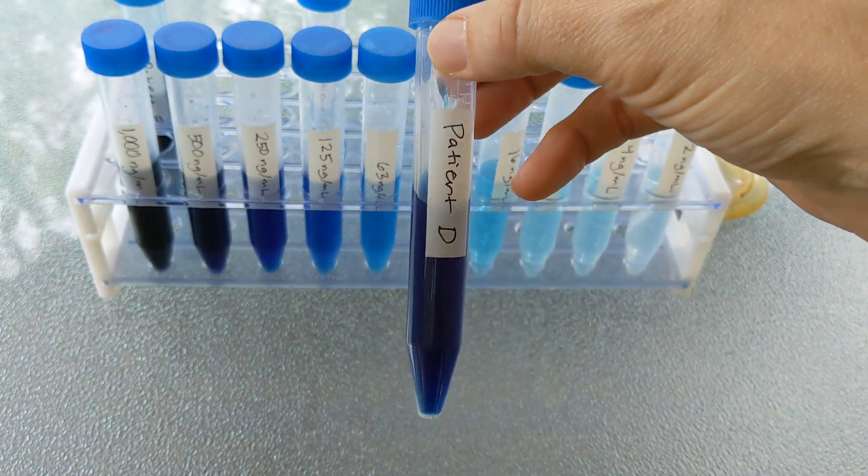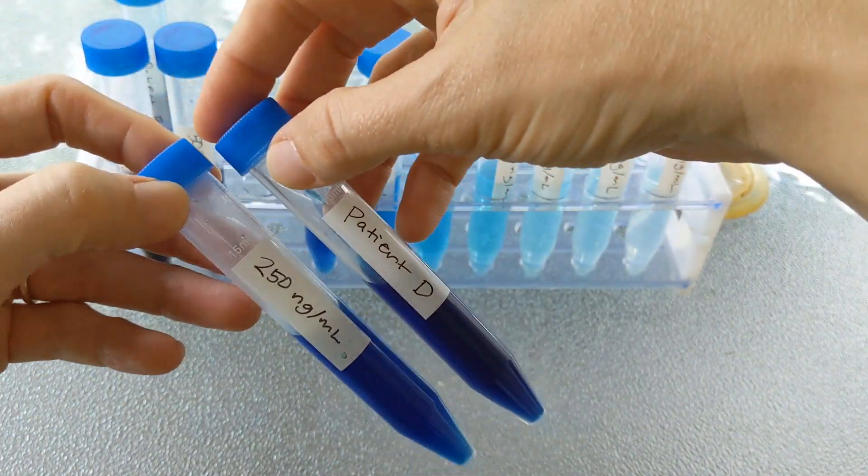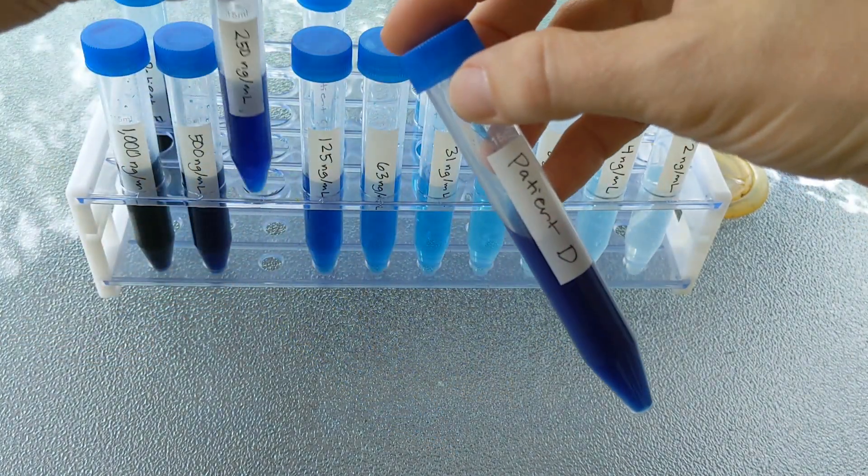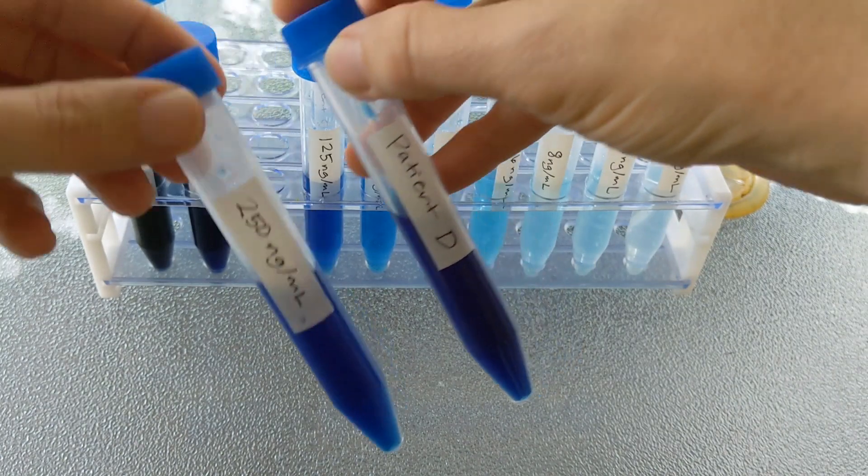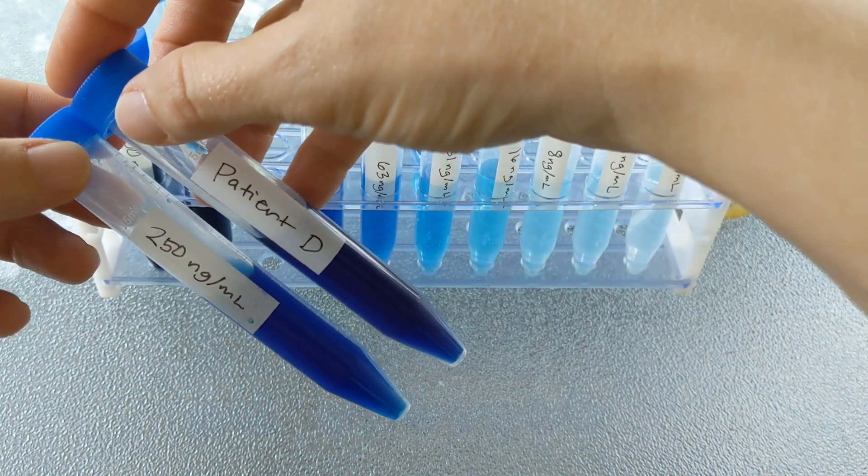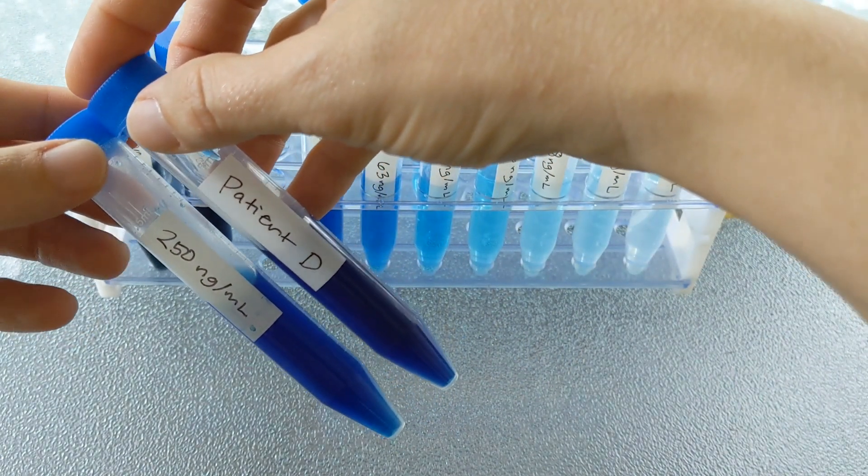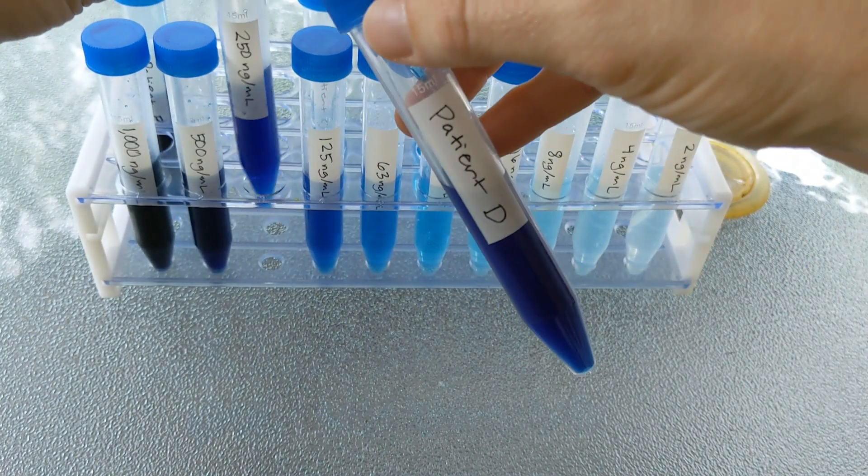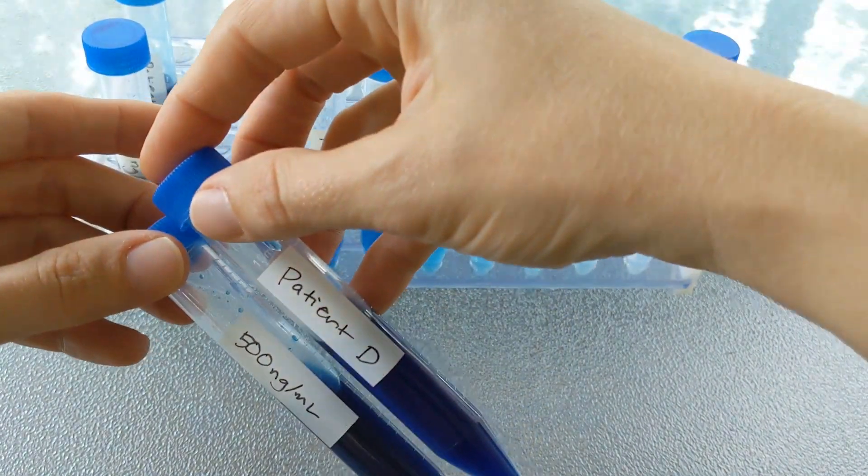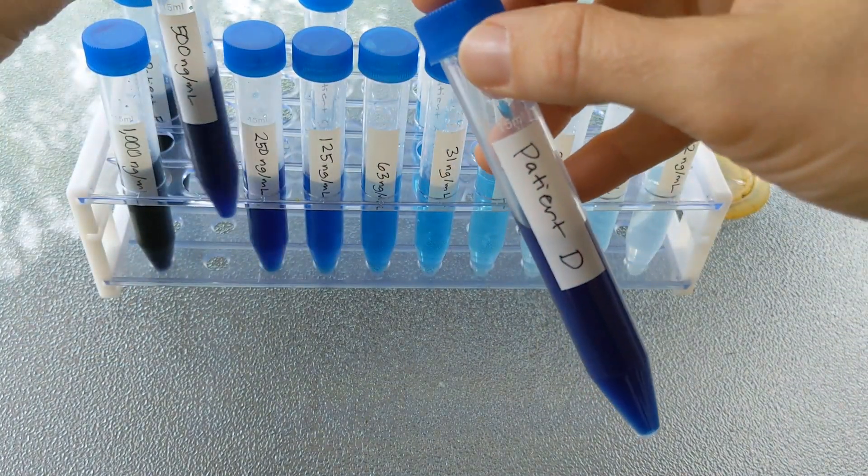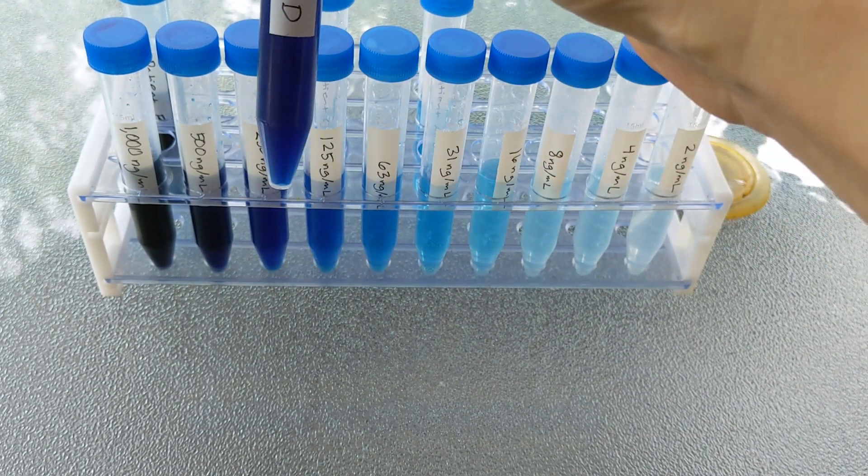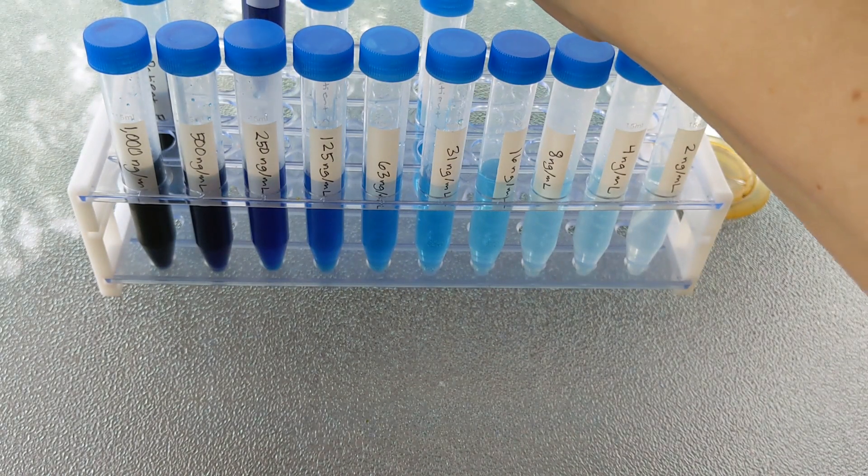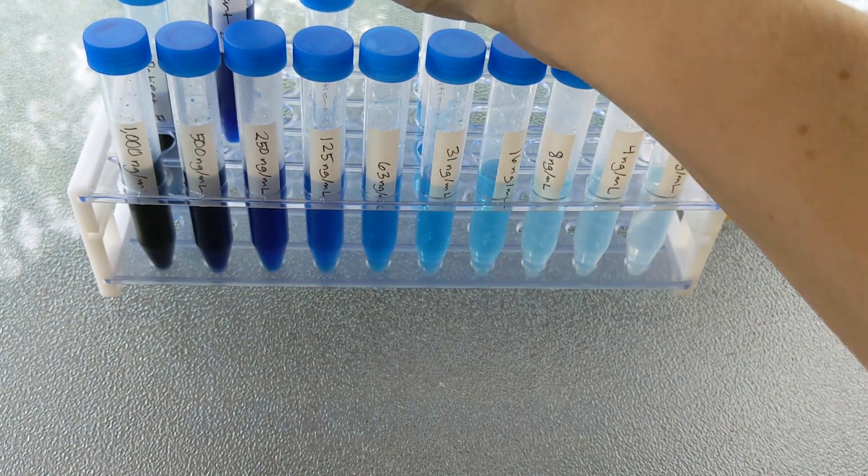Here's patient D. This one's pretty infected again. Do a comparison. I think it was better at 250. This reminds me of being at the eye doctor. Which one's better? It looks a little darker than 250 to me, but not as dark as 500. So for me, I would average those two values. Halfway between 250 and 500 is 375. And I think it's maybe in the middle here. I'm just going to lay this one right here because I can't quite decide.